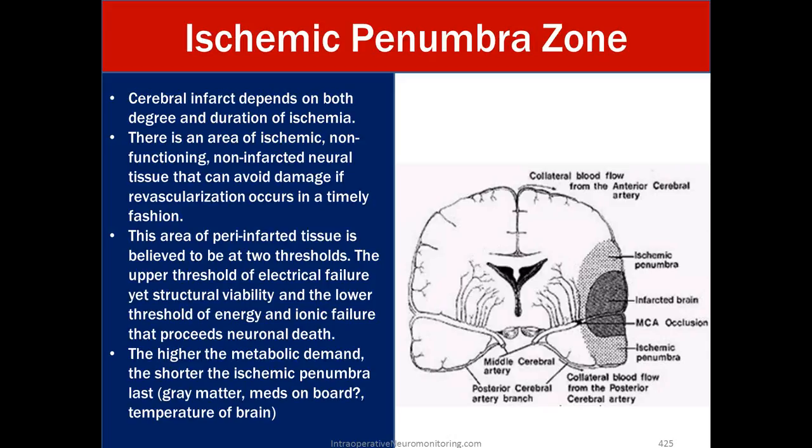So that's why we need fast acquisition. That's why raw EEG works very well. That's why we don't want to have a thousand sweeps on our SSEPs. If we can get it collected in 50 to 100, that's all the better, because time is of the essence.